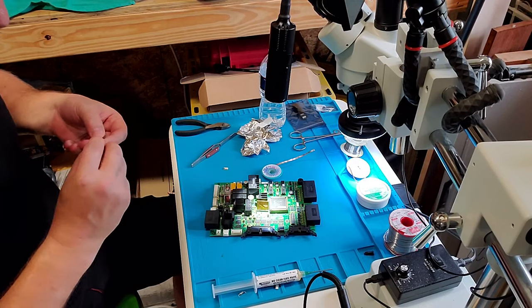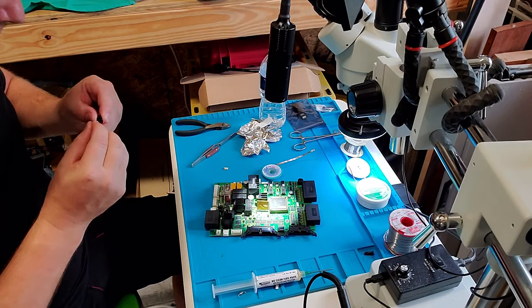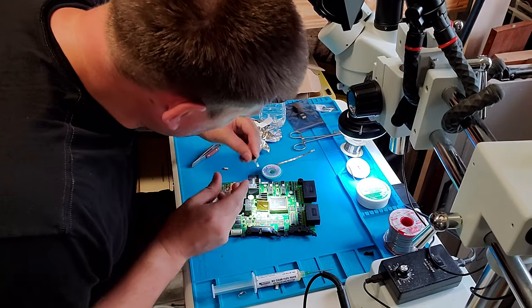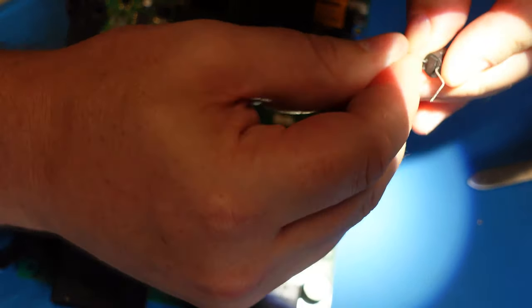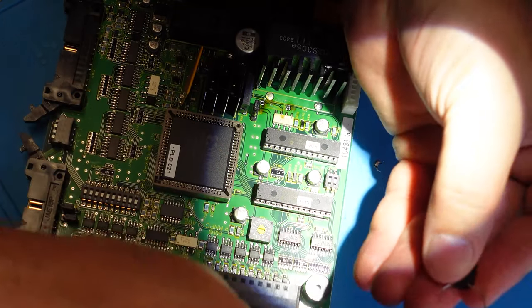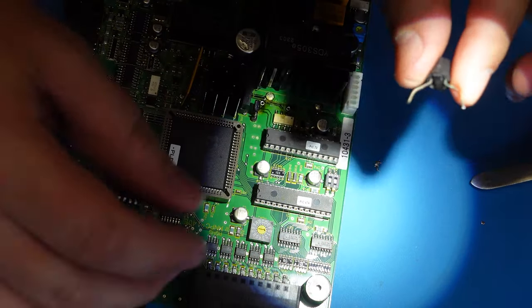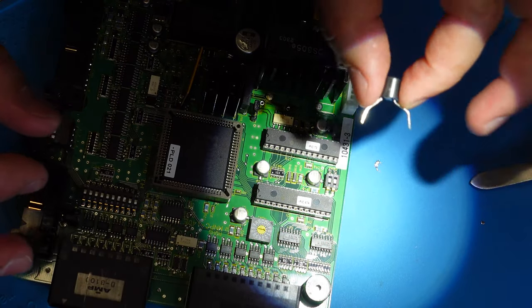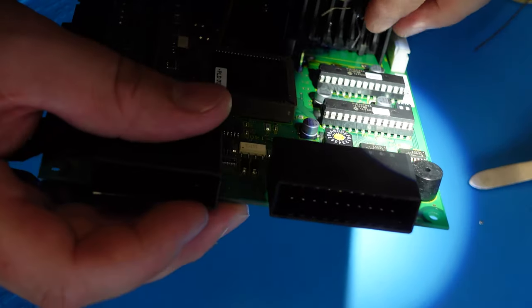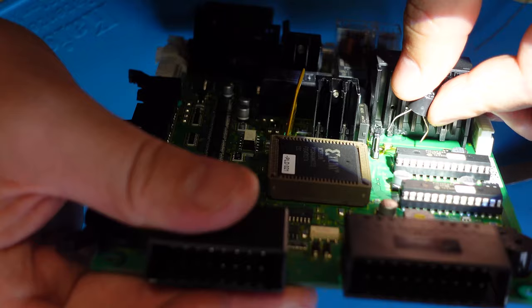Now, I'm going to set the fuse for install. What I'm going to do is prepare this fuse for installation. I'm going to clip the legs down a little bit. There we go. And I'm going to start by putting the legs in the holes.